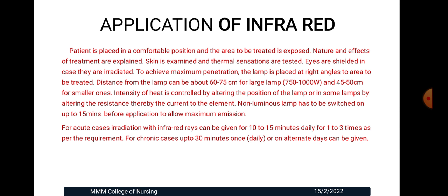Application of infrared. The patient is placed in a comfortable position and the area to be treated is exposed. Nature and effects of treatment are explained to the patient. The skin is examined and thermal sensation is tested. Eyes are shielded in case they are irradiated.